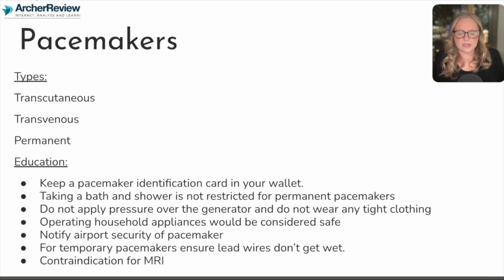All right. So first and foremost, what's a pacemaker? This is an external device used to send electricity through your client's heart. So if they have a heart block and that electricity is not going down the highway like it should, we're going to send that electricity for them. That's where our pacemaker comes in. We've got 3 types: transcutaneous, transvenous, and permanent.